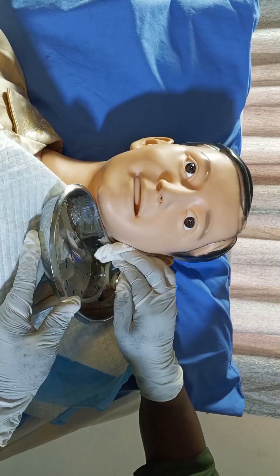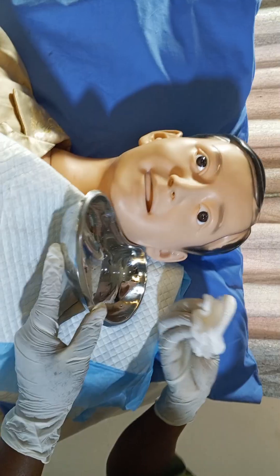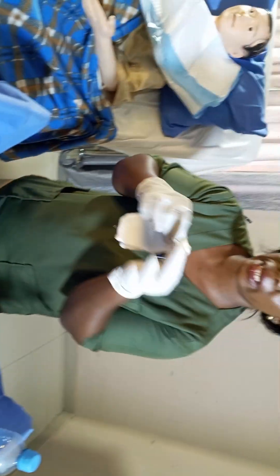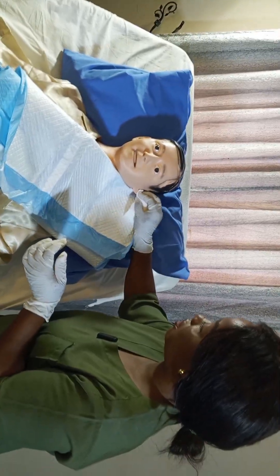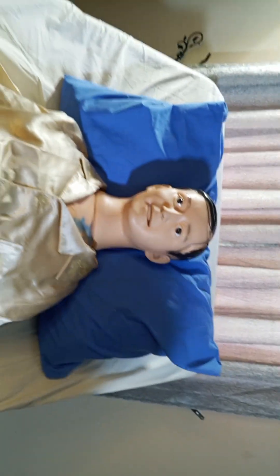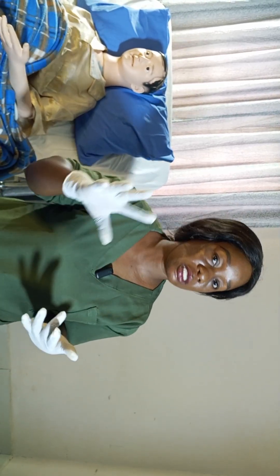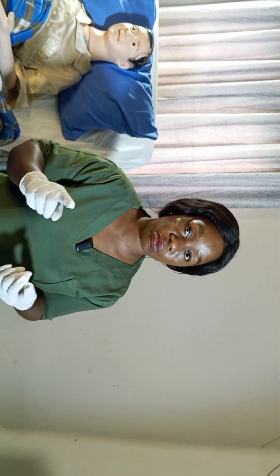Now that I'm done flushing the ear, I use gauze to clean the water that splashes on the patient's chin and discard it in the receiver for used swabs. I put gauze inside the patient's ear to absorb excess water, then remove and discard it. I give the patient tissue paper to clean their chin, then collect and discard it. Remember, this procedure is done for patients who have insects in the ear, impacted wax, or foreign objects in the ear canal.